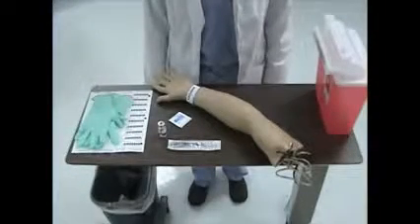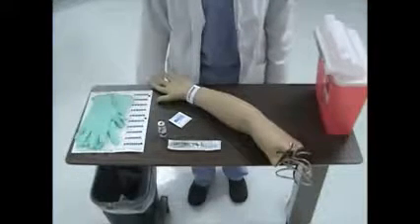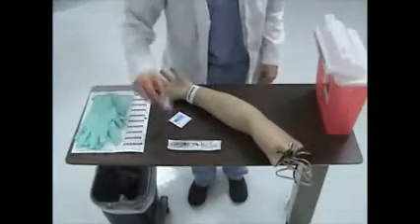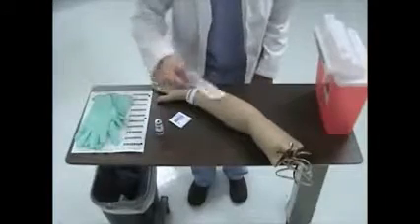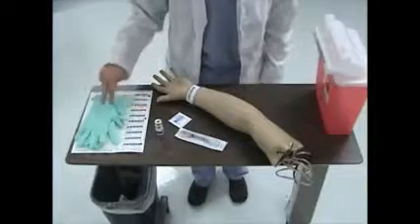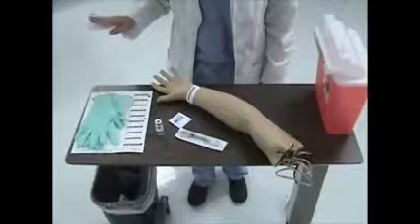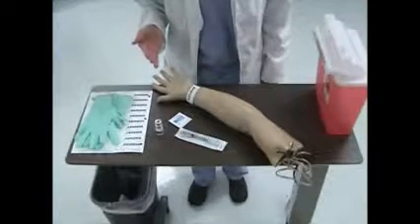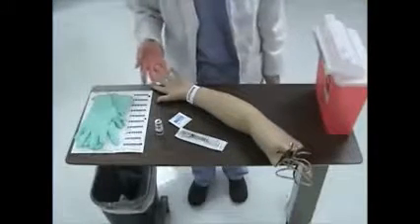This is a demonstration of administration of an intradermal injection. To begin, I will gather my supplies and check my PCP order. I need a vial of PPD solution, a tuberculin syringe, alcohol preps, patient labels, gloves, a sharps container, and a trash can. I will begin by entering my patient's room, washing my hands, and then I will identify my patient.